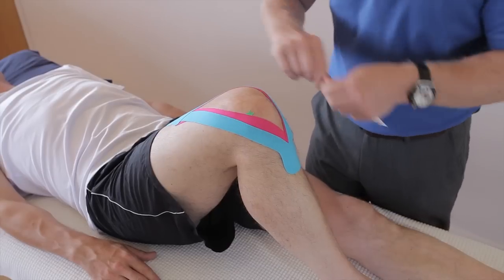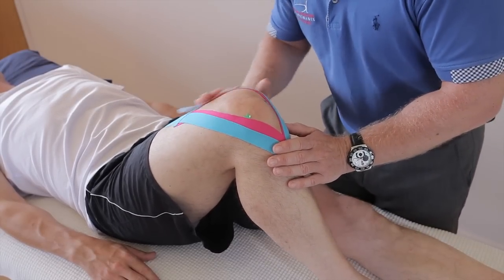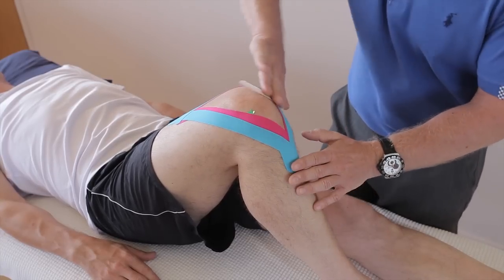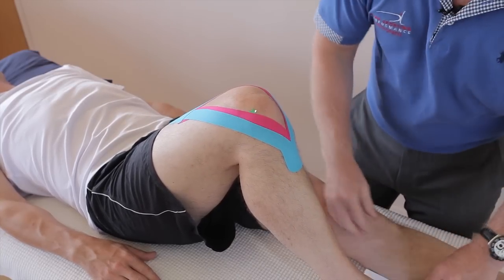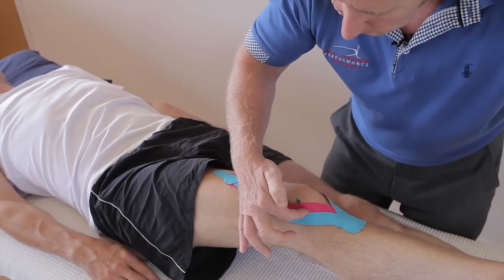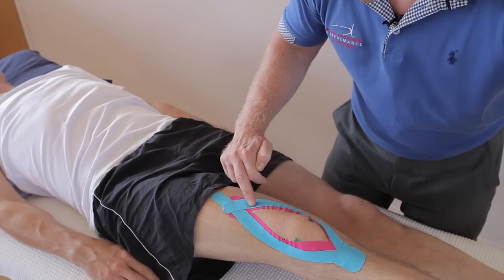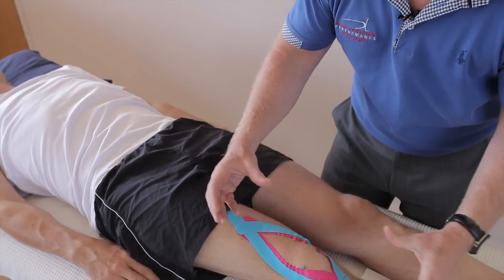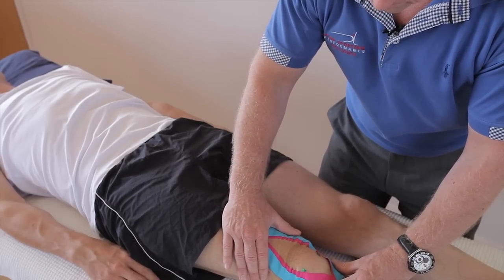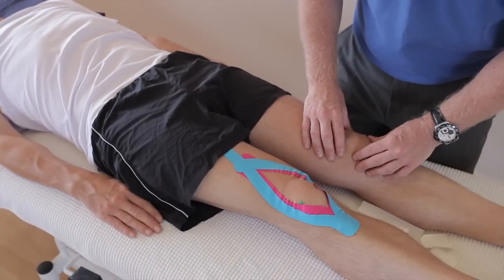Using the back of the tape, we can heat activate the glue just so it sticks a bit better. Now when we slowly straighten the leg, you'll notice the tape crinkling on the lateral side and on the medial side. You can see exactly how the kinesiology taping works by causing the lifting effect on the skin. And there you have kinesiology taping for anterior patellofemoral pain.